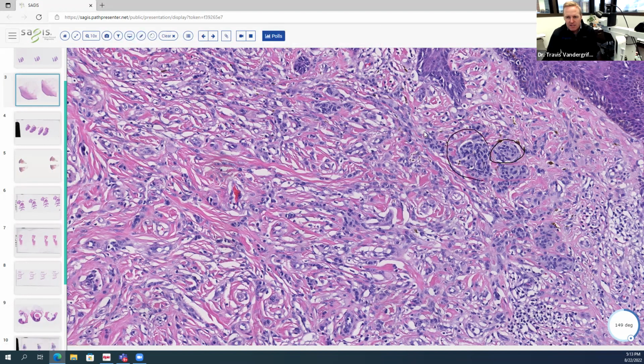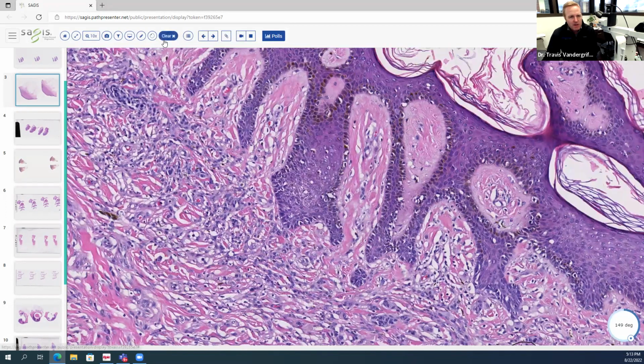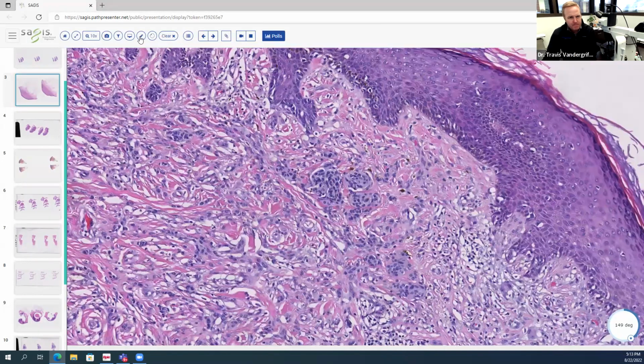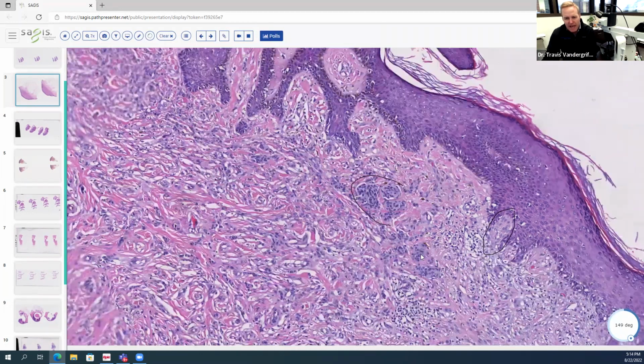These are melanocytes. I can also go to the overlying epidermis and see there's a little bit of a proliferation of single melanocytes in the junction, a pattern that we would call lentiginous, meaning increased single cells along the junction. But for the most part, this is a dermal-based neoplasm. Here at the edge, I've got a junctional nest. So this is confirming our impression of a melanocytic neoplasm, a compound process because we've got junctional and dermal nests.